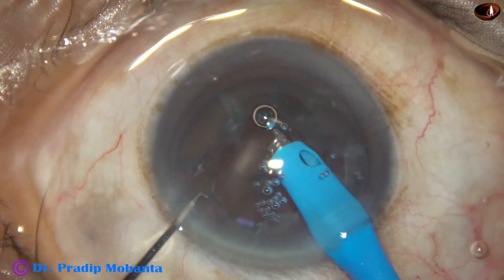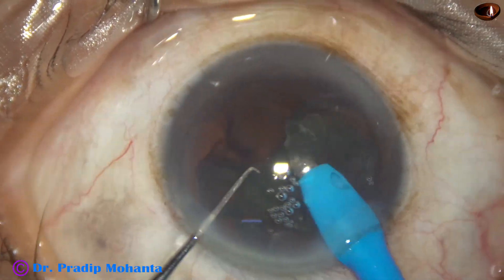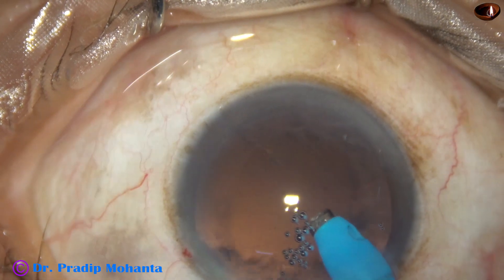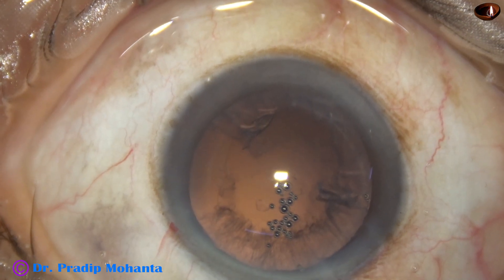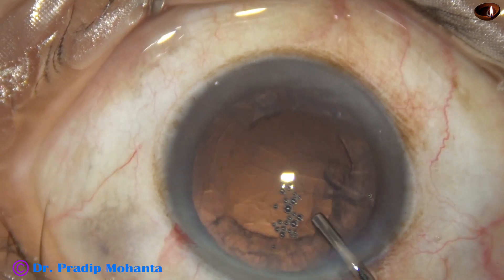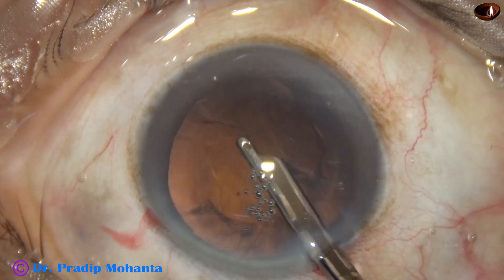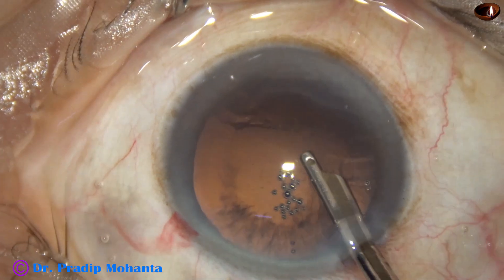Now this thick epinuclear shell is being drawn with 450 vacuum, and now the vacuum is reduced to 350. We have some cortex remaining; some more visco is added, and now a Simcoe cannula — 23 gauge Simcoe — is taken and the cortical matter is removed.